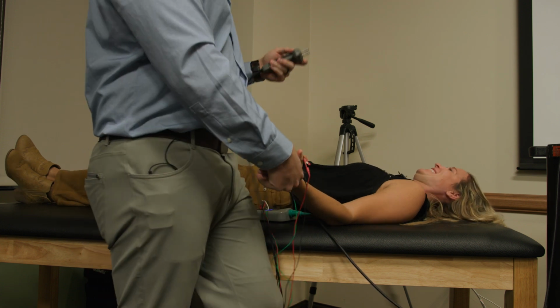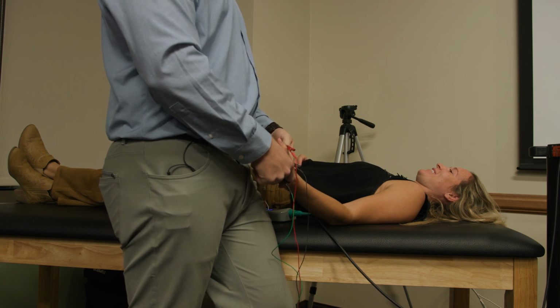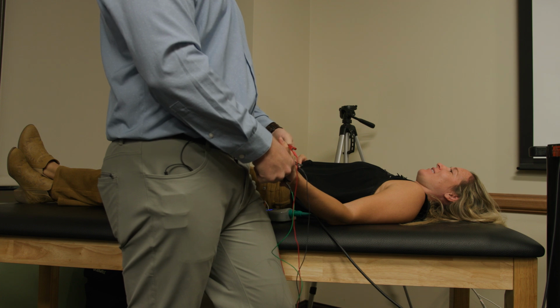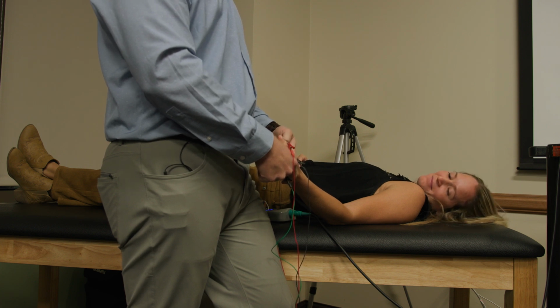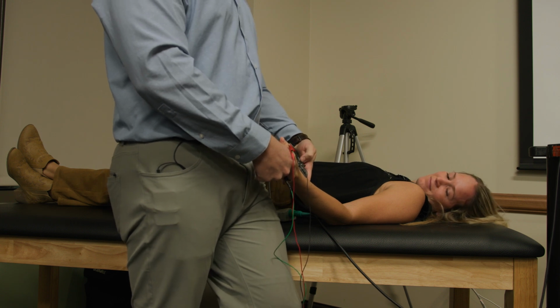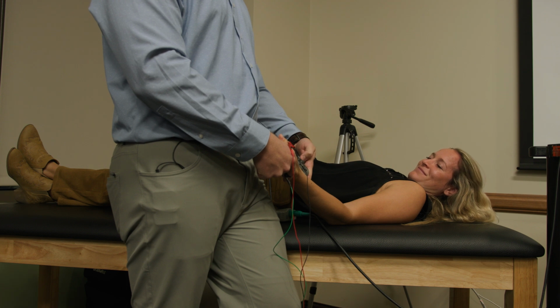Excellent. Okay. Starting in the palm of the hand, it starts off small, kind of tappy feeling, and we'll just get gradually a little bit stronger. As it gets stronger, you'll feel your thumb twitching. And then we're seeing a nice response come there from the median nerve. And then I'm coming down to the wrist. This one is the same thing. It feels a little snappier just because the skin is a little thinner at the wrist.